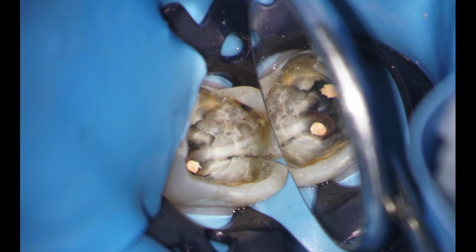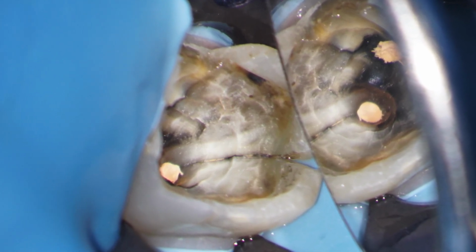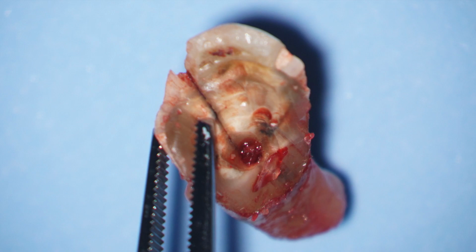Further investigation was carried out under the operating microscope, and here at high power you can see that the crack propagates to the orifice of the distal canal. Once I'd removed some GP, it was obvious that the crack was descending down the root, and unfortunately there's only one recourse for a tooth like this. It has to be extracted. And here sadly is that distal root, with the crack very evident.